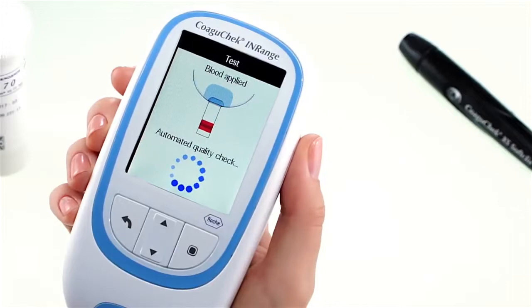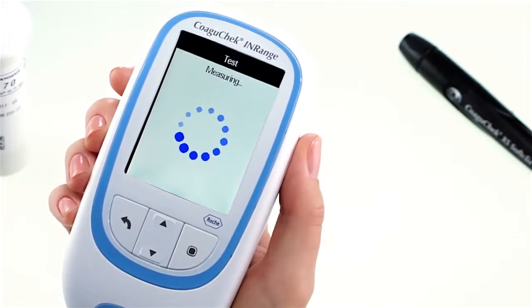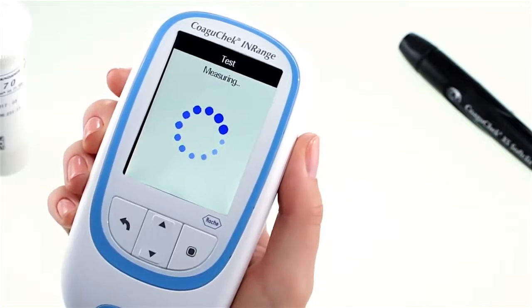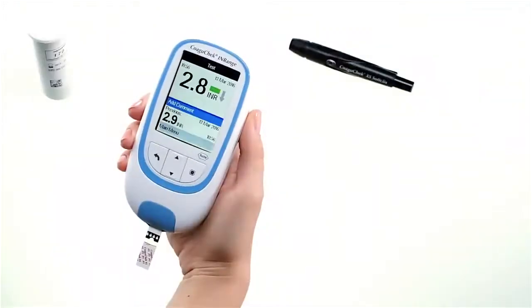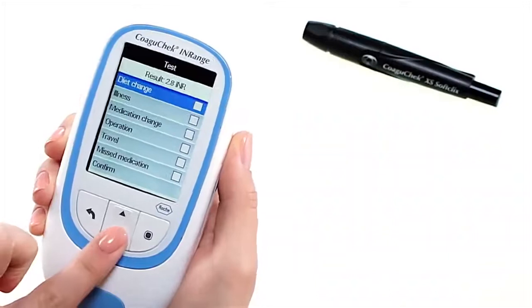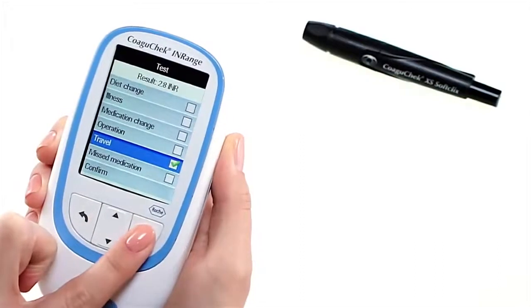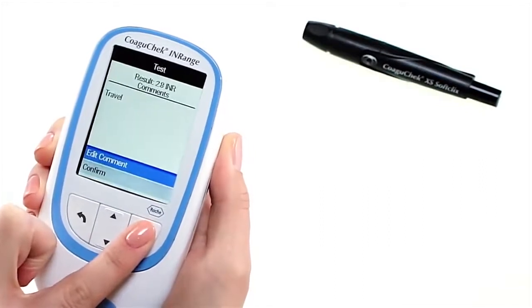Do not touch the test strip until the result is displayed. In the background, the meter now performs an automatic quality control check of the test strip and the coagulation measurement starts. The circular indicator lets you know when the meter has determined the result. The result is displayed. If you wish, you can add up to six predefined comments to a test result. Comments can, for example, provide additional information about the test conditions or your general state of health to help you understand what could impact your result. These comments can only be added immediately after the test result is displayed and before the meter is switched off.